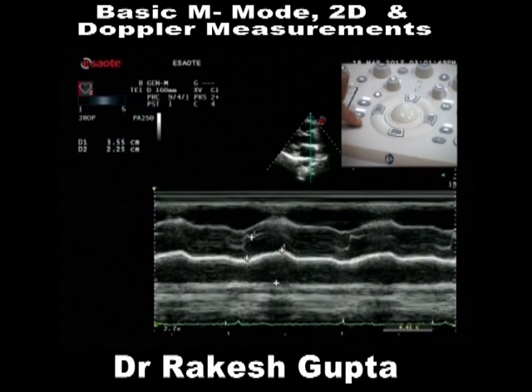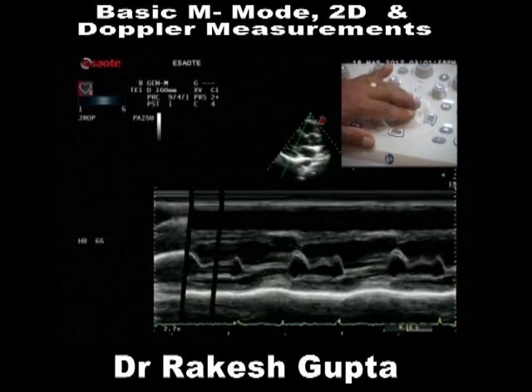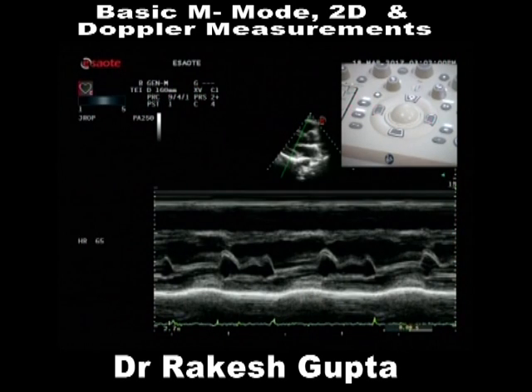Now switch off measurement by pressing measure. Now I am scrolling my image. Out of these, I have to look for the best M-mode. I am going to say measure now. Look, as soon as I click measure, the mitral valve, Gopalji.